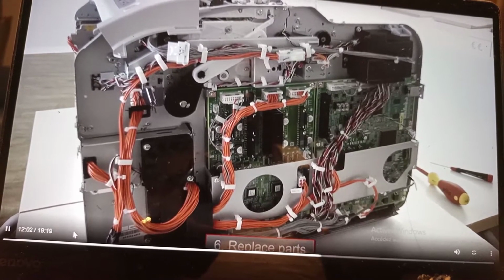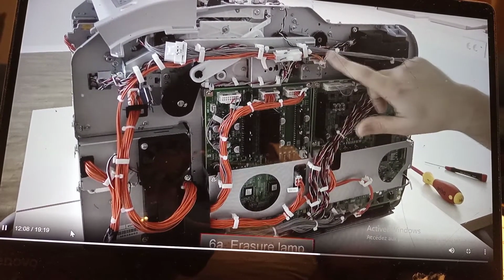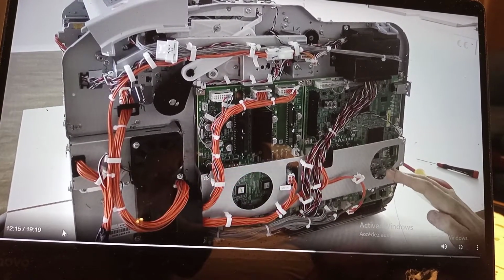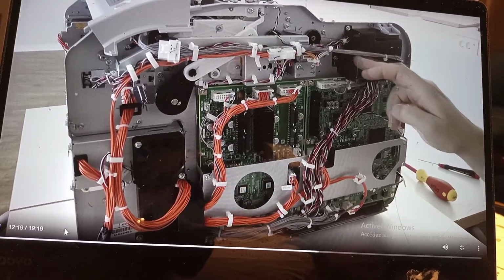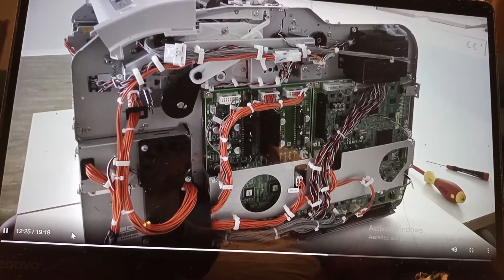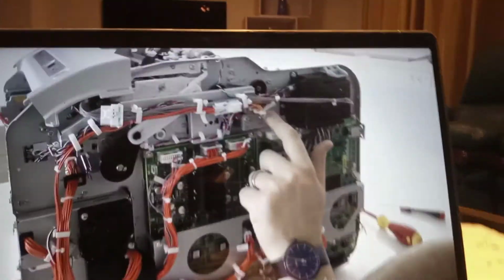The first one will be the erasure lamp. So during the readout process the image plate will go like this and will be read out in this area in the device, and during push back it will go through the erasure lamp and will be erased during putting back in the cassette. So to change the lamp, it's one big part.